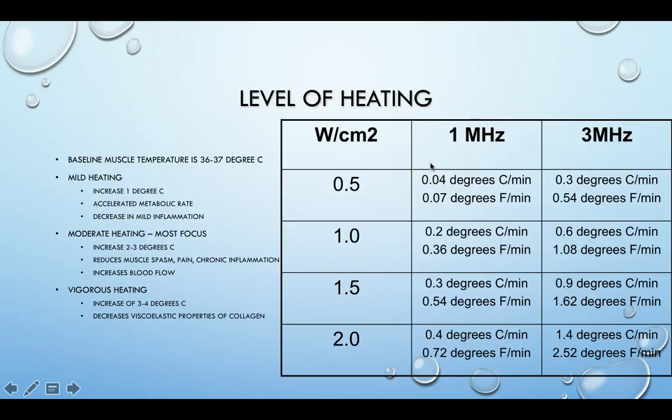But what we see over here is that based on the intensity that we set, our watts per centimeter squared, and based on our frequency, we will raise the temperature at a different level.